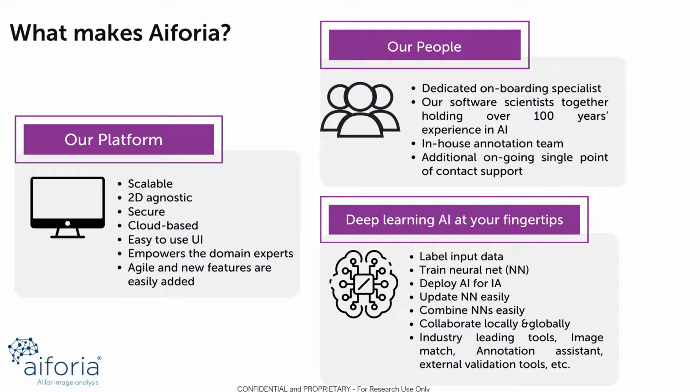In that way, we've worked tirelessly to create an easy to use interface. We really want to empower our Aiforians and our users to be their own experts and to be able to creatively and flexibly build these AI models. We're always adding new features, which, in a very short 30-minute session once a month, we'll display, along with the latest, greatest tools and tricks in this AI Unbounded series.